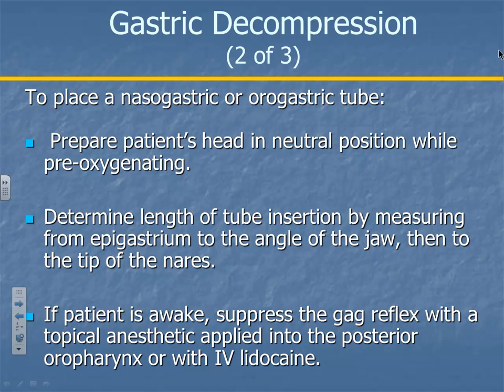You want it in the stomach. So you tell the patient, you just keep swallowing, you keep swallowing. And then after you pass the trachea, now they're going to help pass that with their swallowing. So it's important that you have them swallow, have them sit forward, lubricate it, and have them swallow it. Now you want to make sure you measure it before you start to make sure it's long enough to hit the stomach.